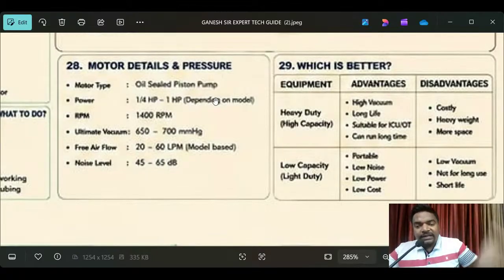From here it goes to the filter, to the pressure gauge, to the jars. Then from the jars to the patient chamber. For the patient connection, we use suction with a catheter. These are very easy functions, but very important to take care of in our work. If a suction machine is not working, the doctor will suffer and panic. If something is stuck, there is going to be a mistake, a problem, a blockage, and then major problems will be created.